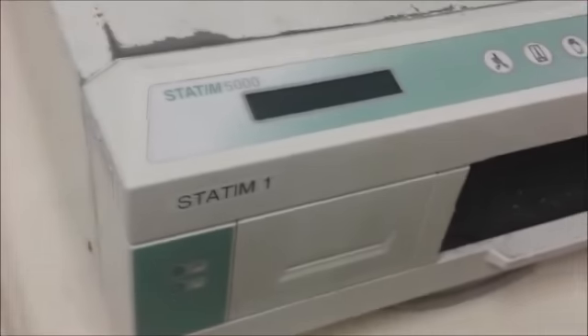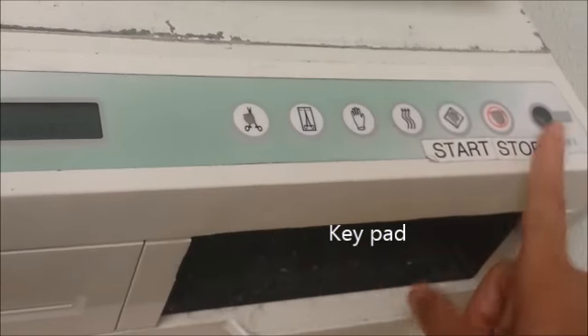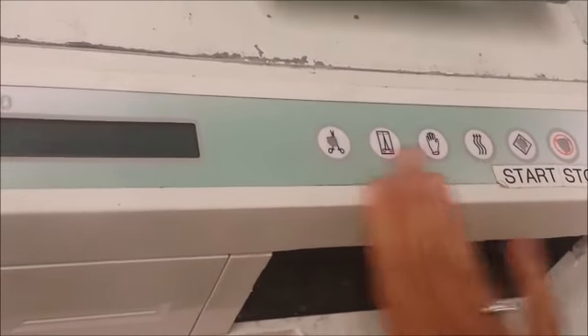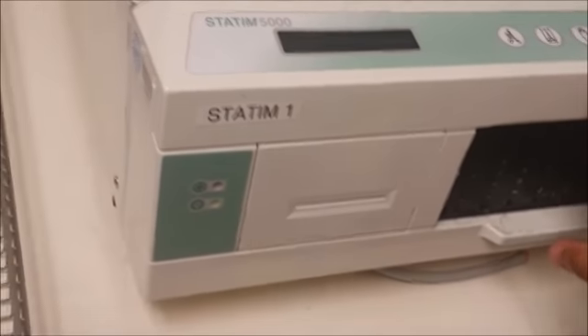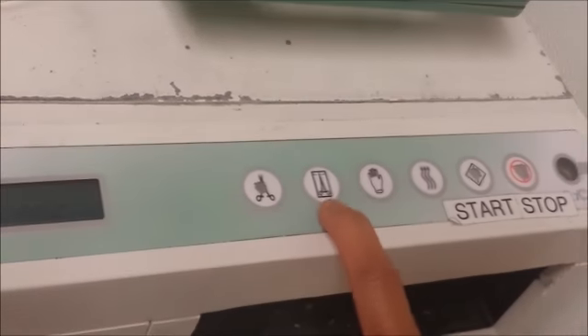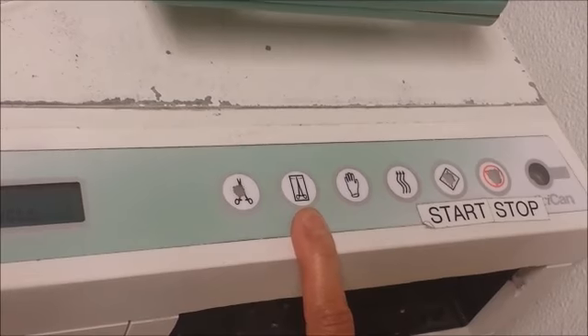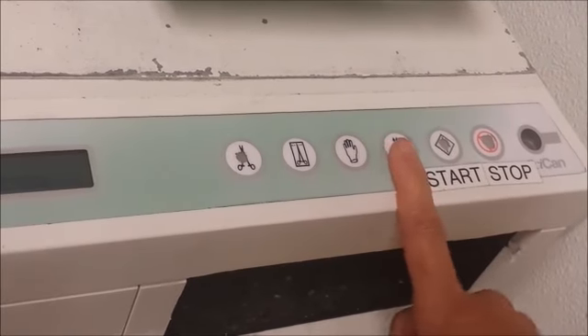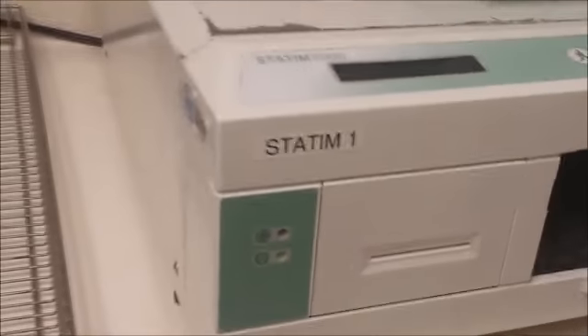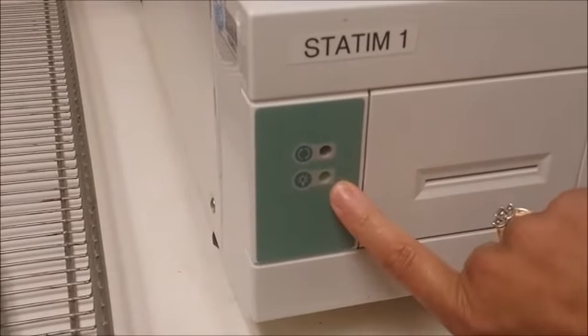Your keypad consists of these buttons right here. You'll notice they have little diagrams on them. The start and stop are labeled, and then these four are all for various cycles. Primarily we'll be using the unwrapped cycle, which has a little hemostat, and then the wrapped cycle with a hemostat in a bag. There is also a heavy-duty rubber cycle, which we will not be using here at MSU. The power indicator is right here on the front.